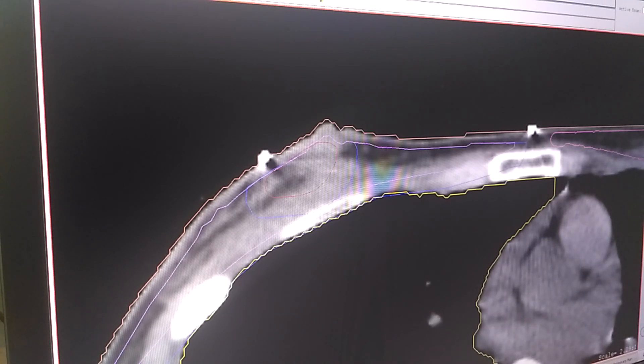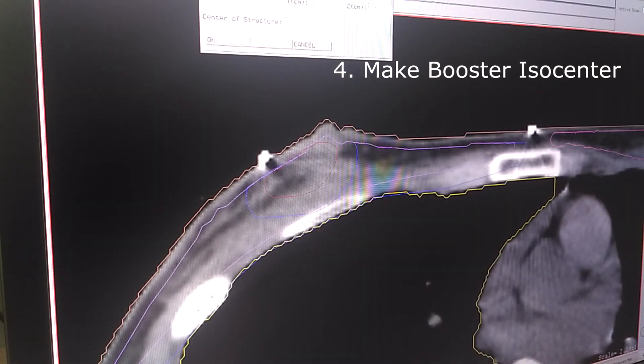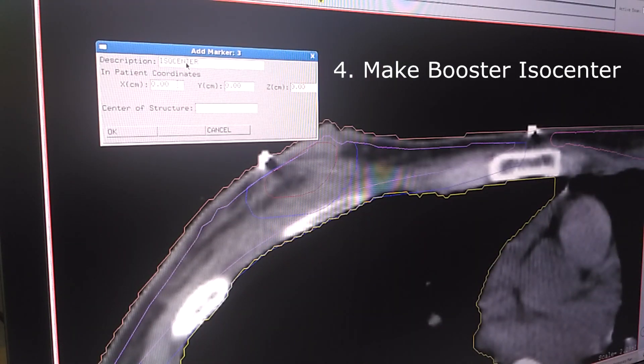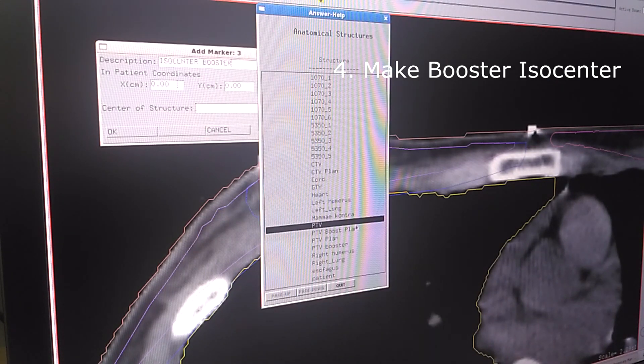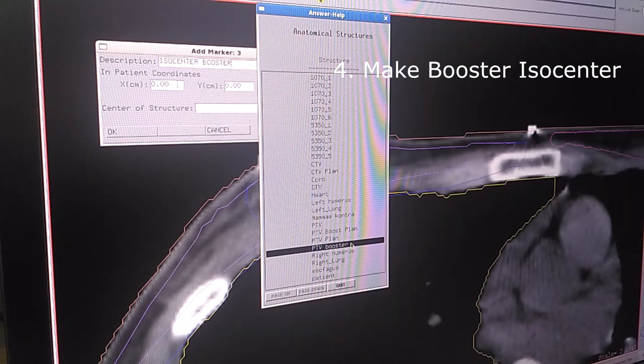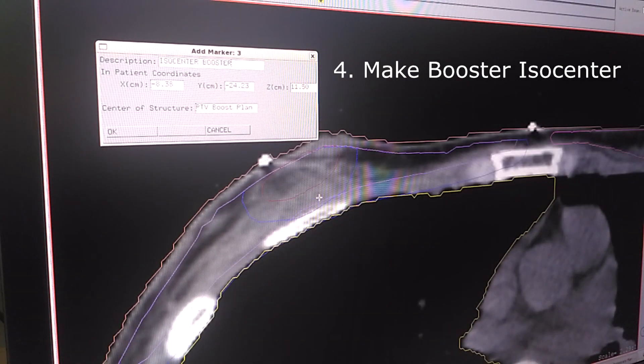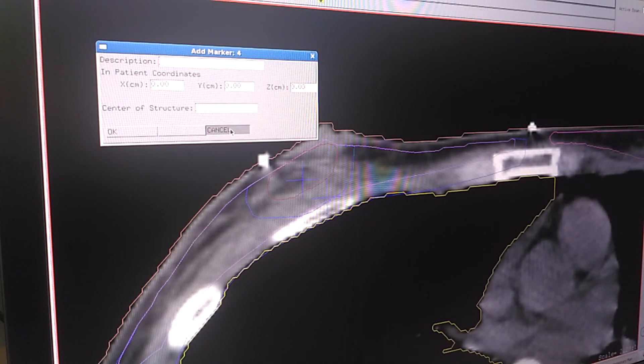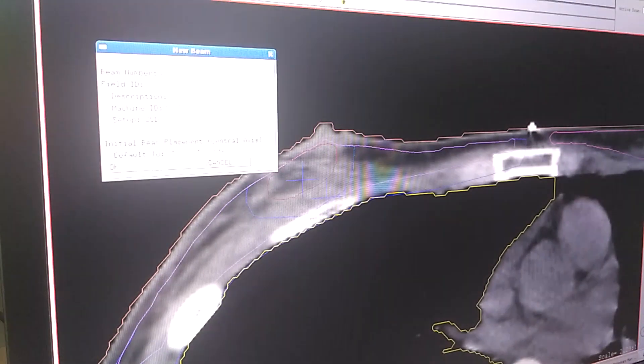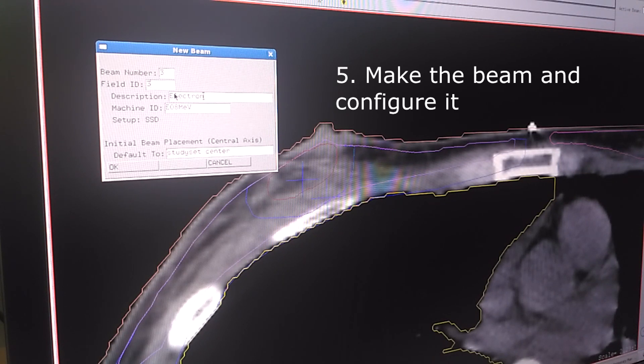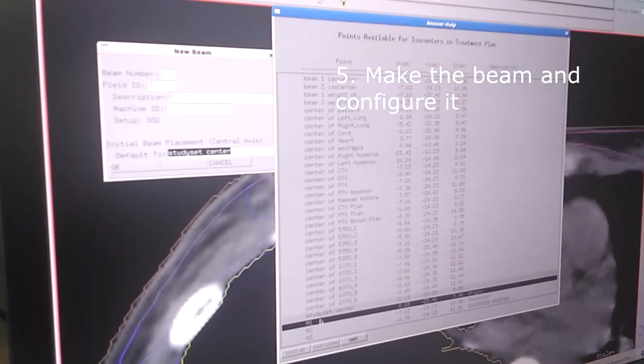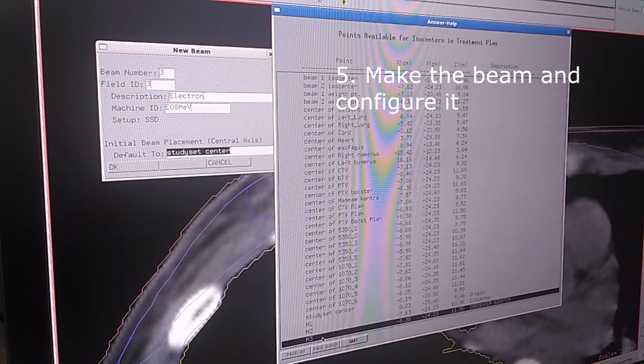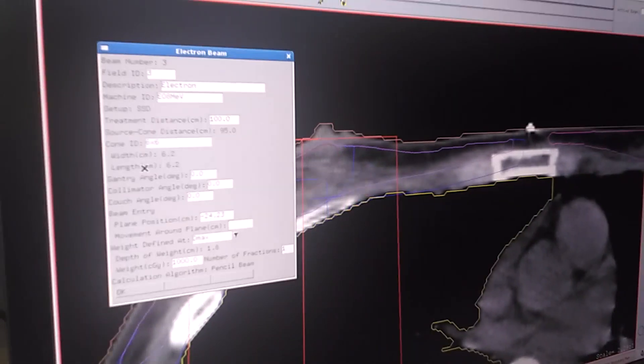The next thing I'm going to do is make an ISO center for the booster. ISO center booster in the center of structure PTV booster. This is here so it's good. Click OK and then we're going to make the beam. For example I'm going to use 8 MeV beam and the initial beam placement is the ISO center we just made. Click OK.